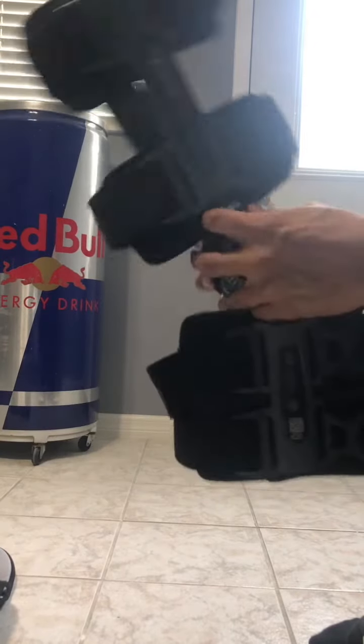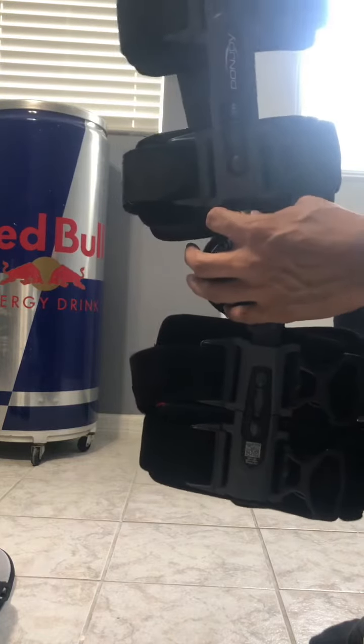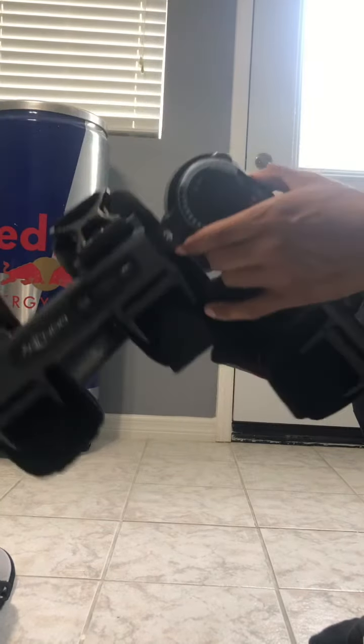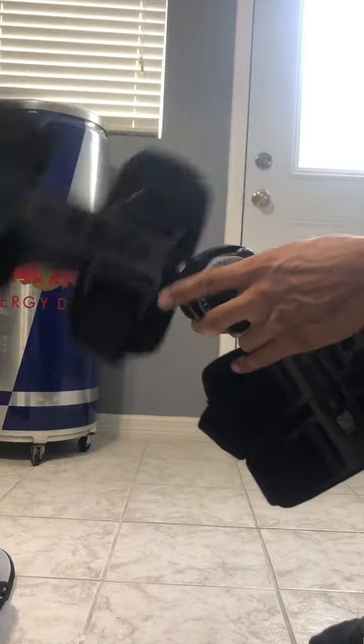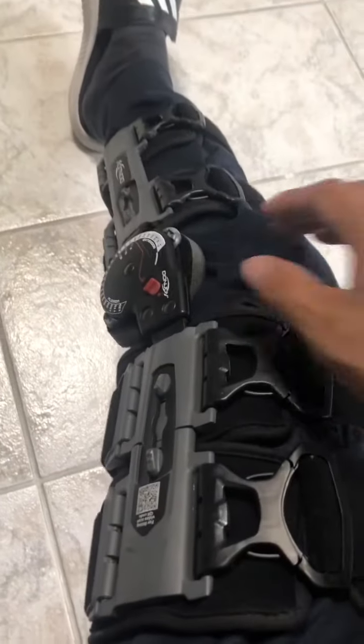After any kind of knee or leg surgery — whether it's ACL, meniscus, or whatever — you are going to need one of these, at least for the first few weeks. This is going to be your best friend. This is what it will look like.